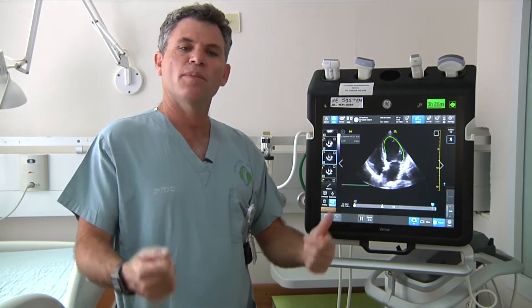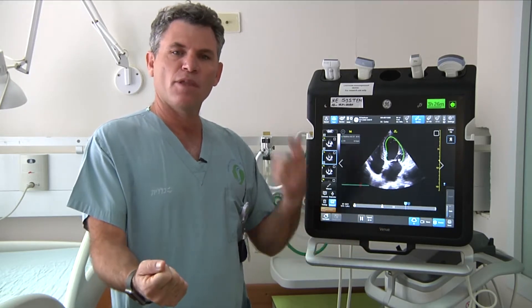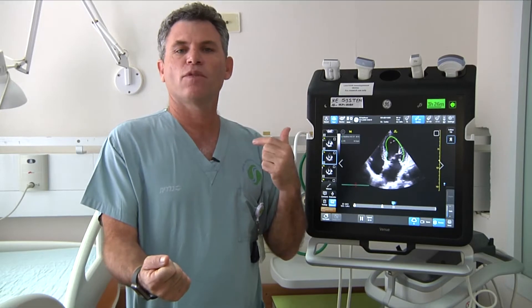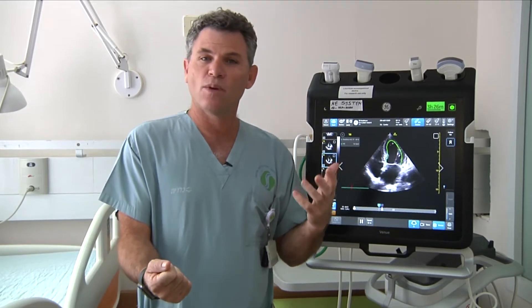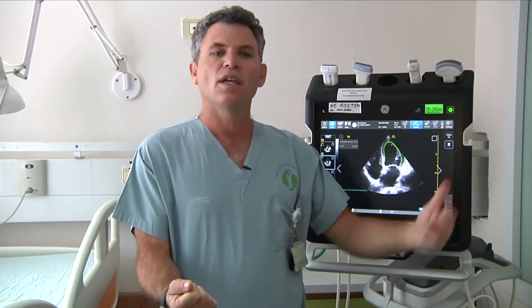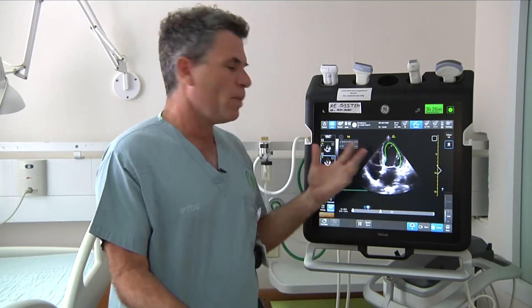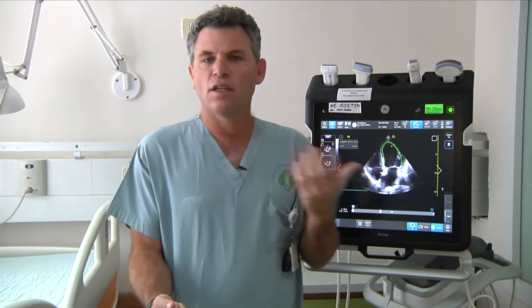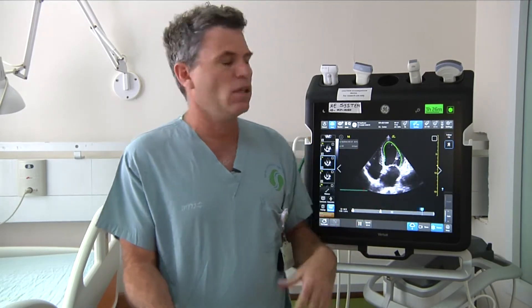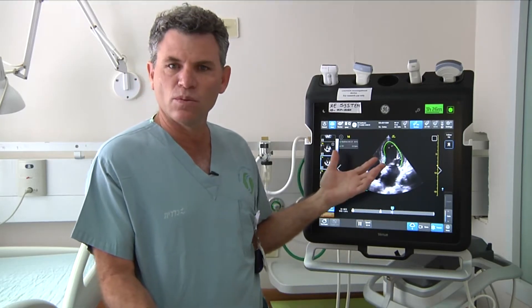So at the bedside, while I'm scanning, I'm thinking to myself: what would be the right, correct EF? And then looking at the screen, immediately getting feedback, getting the number, and comparing my initial thought with the automatic tool result.